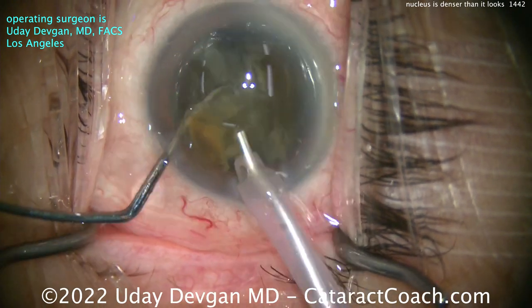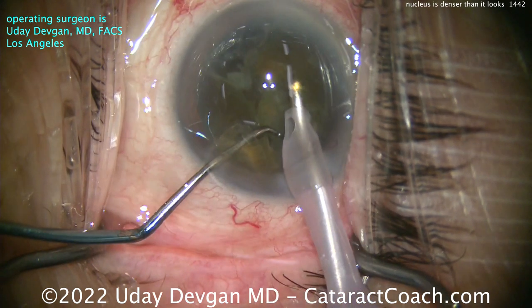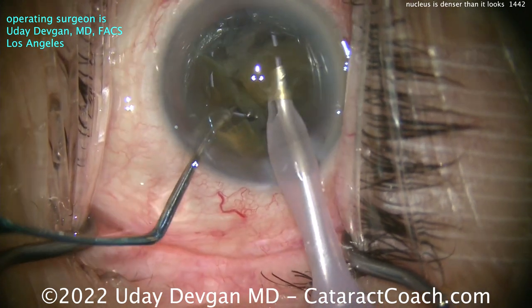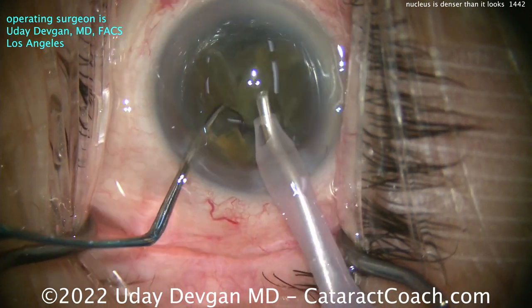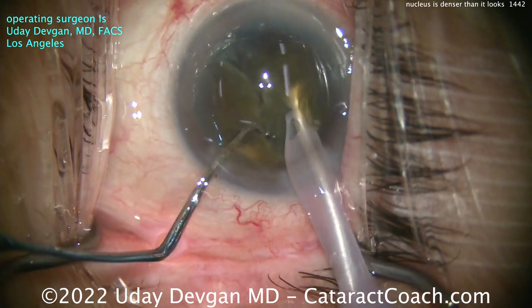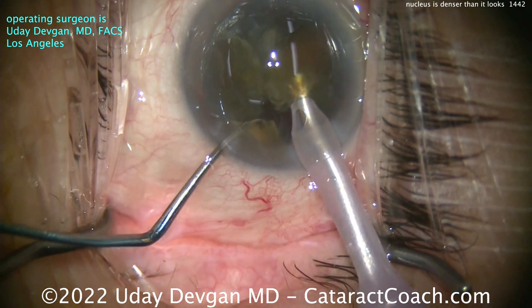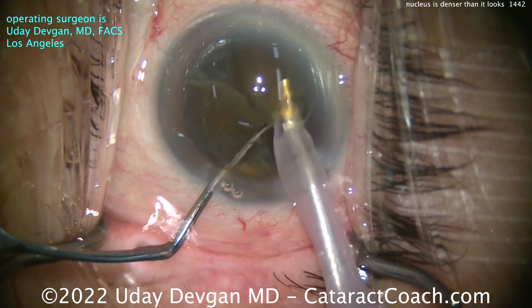Now you can see the nucleus comes up. There's certainly an increased density there. So I'll break off a little small piece of that first heminucleus, put the phaco probe in again, and let's see if we can further sub-chop it into smaller fragments. Still working kind of centrally at about the iris plane — I want to bring the pieces up. You can see now this nucleus certainly has a good amount of density.